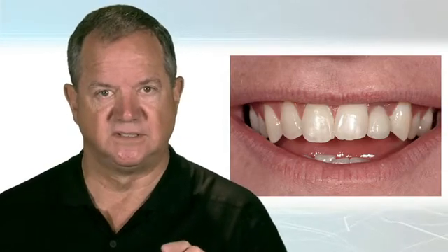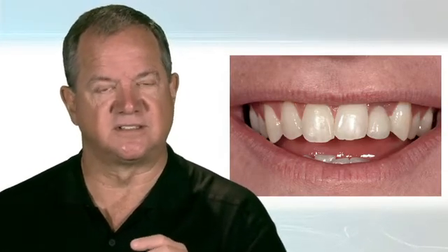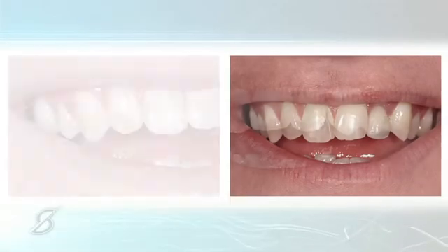Well, the obvious problem with it is it's too short. And it's too short because it's the same exact problem. The abutment comes up through the tissue and then the crown form starts. The technician didn't modify contour at all to push the tissue up into place.